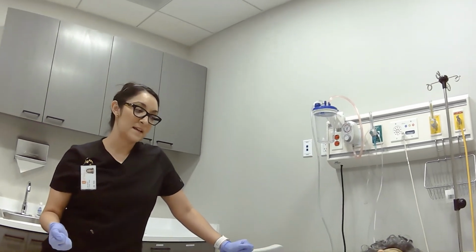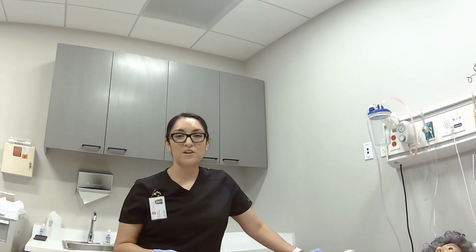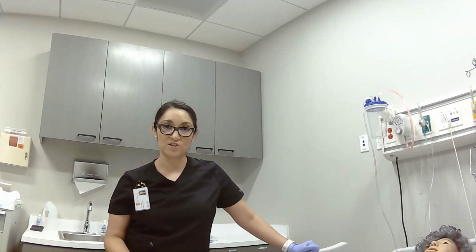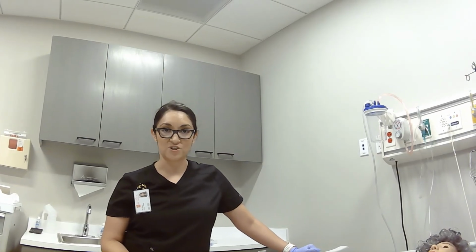You want to come back and assess every hour to make sure that the patient voids on their own. If they are not voiding within 4 hours, then you'll need to alert the physician or the provider, because that could indicate that the patient is retaining urine.